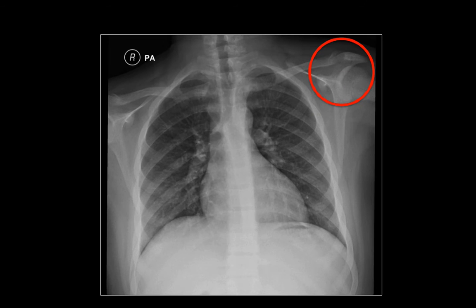Now let's look carefully at the contralateral side. Although it's partially visualized on this radiograph, you also notice that there is an ill-defined appearance of the lateral aspect of the clavicle.